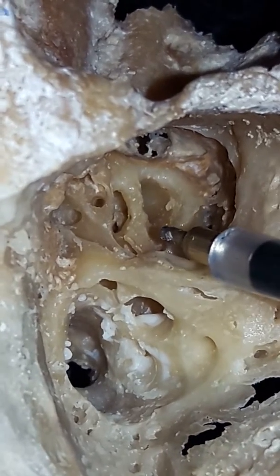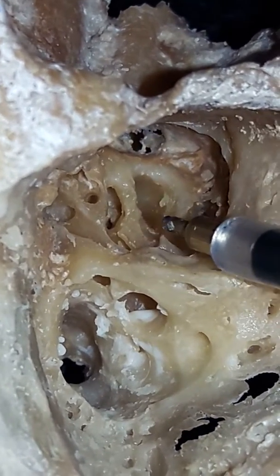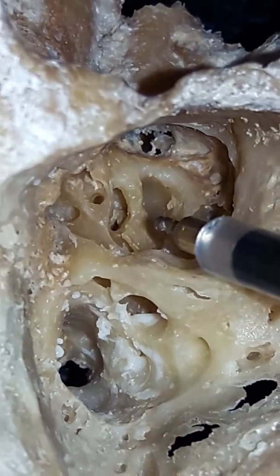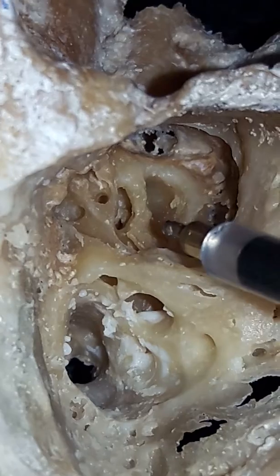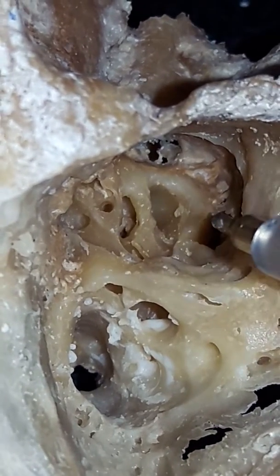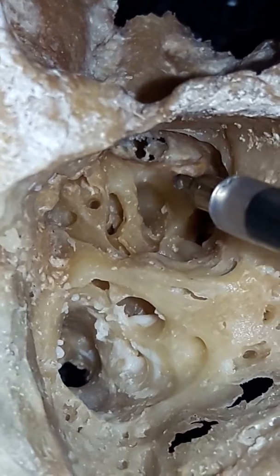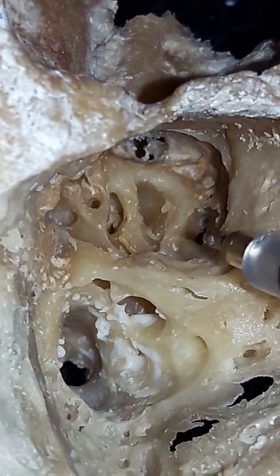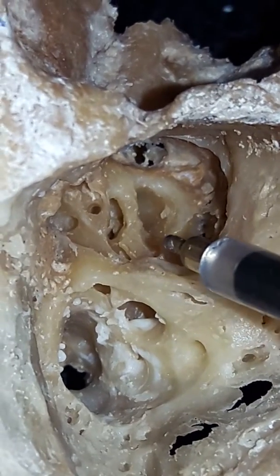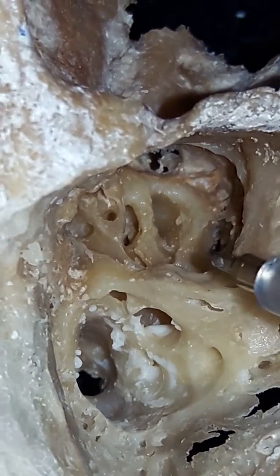So we make an antero-inferior cochleostomy, or Dr. Satish Jain advocates an inferior cochleostomy, and when we drill in the direction of the outer wall of the cochlea, this is the outer wall of the cochlea here. These are the hypotympanic cells. When you don't identify the round window, there are two things.